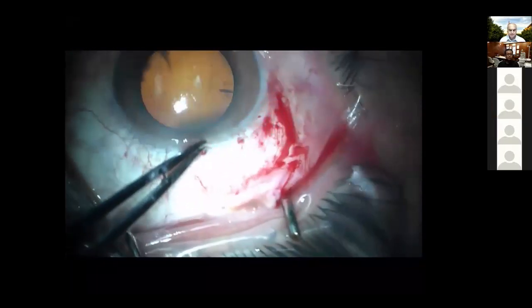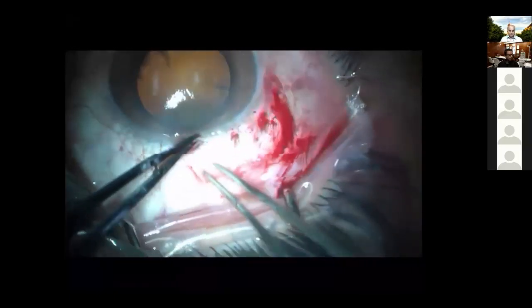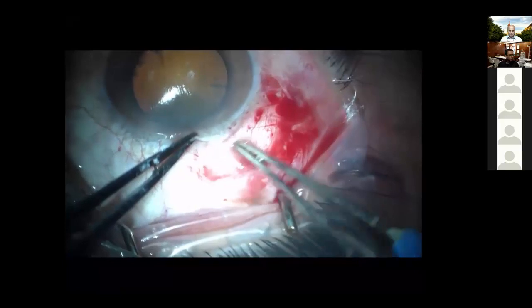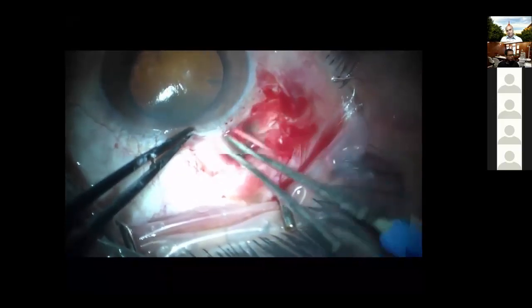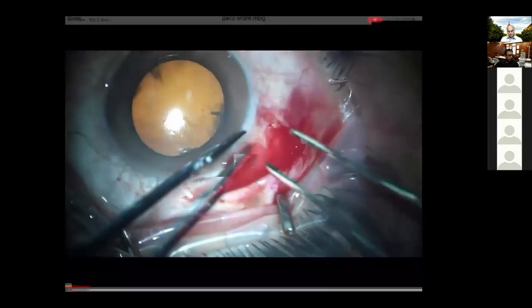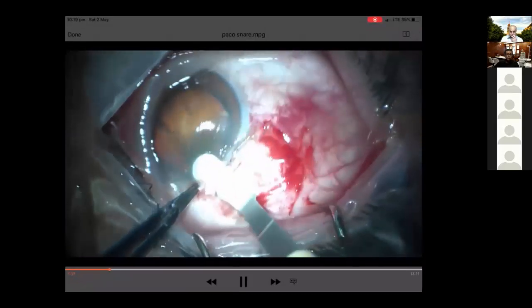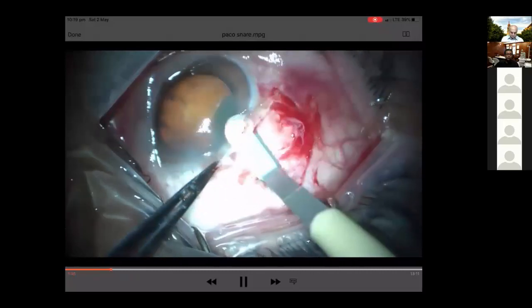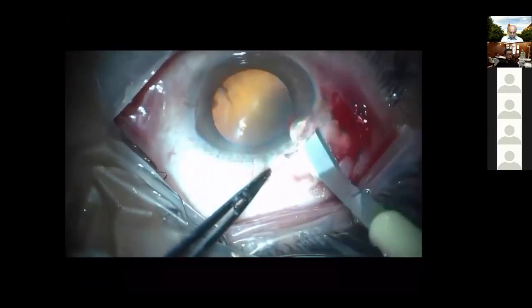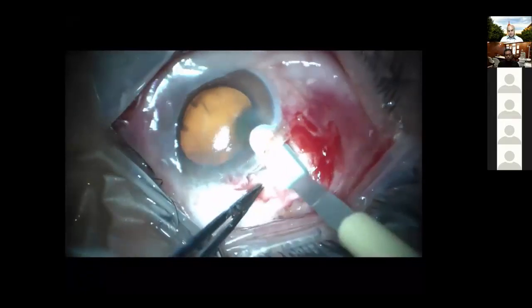In order to reduce the astigmatism in such cases, we prefer to use a scleral tunnel, which allows us to enlarge our incision and not induce much astigmatism postoperatively. And then we perform a scleral tunnel incision. I'm going to increase the speed of the video. The scleral tunnel incision has to be about 2 to 3 millimeters in depth through clear corneal tissue and as wide as you see fit in order to remove your lens fragments after you perform your phaco snare.